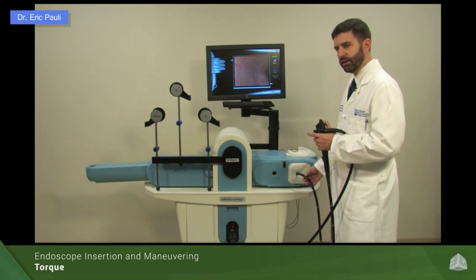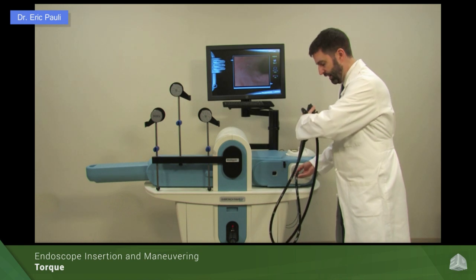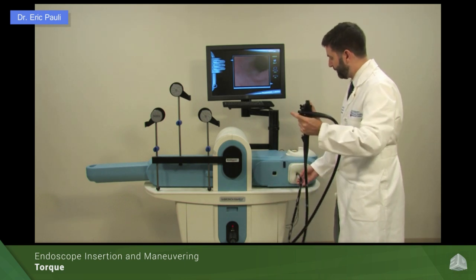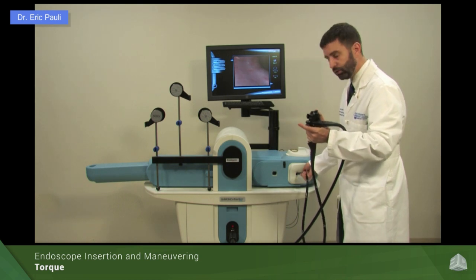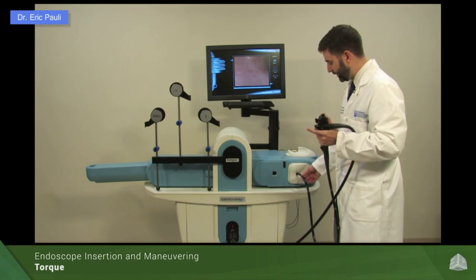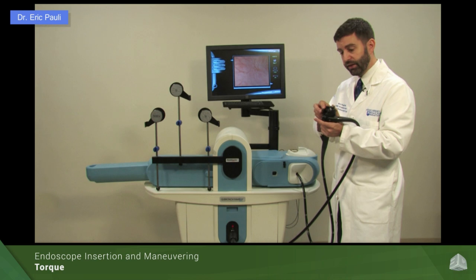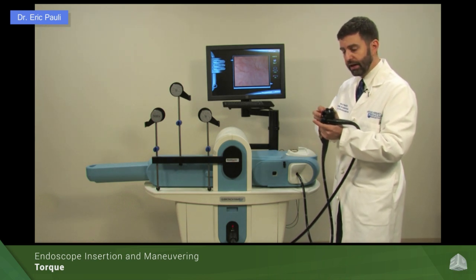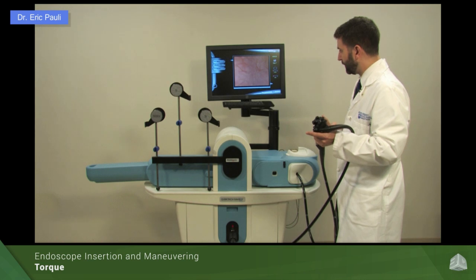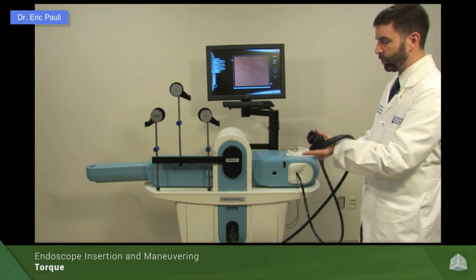Torque doesn't always translate into one-to-one motion. If you have a large loop in the scope and you're trying to torque with your left hand, that loop will absorb a lot of the energy of the torque, and you might not see as much motion on the screen as if you're torquing with your right hand very close with no loop involved. So we want to be careful and pay attention to how we're doing the torque. Many times you don't have the ability to have your hand on the insertion tube to provide torque, and in those circumstances, if I'm doing a very fine maneuver or working an instrument, that torque is going to be done with my left hand — and on the screen you can see that while I'm torquing a large amount, the image is not moving very much.